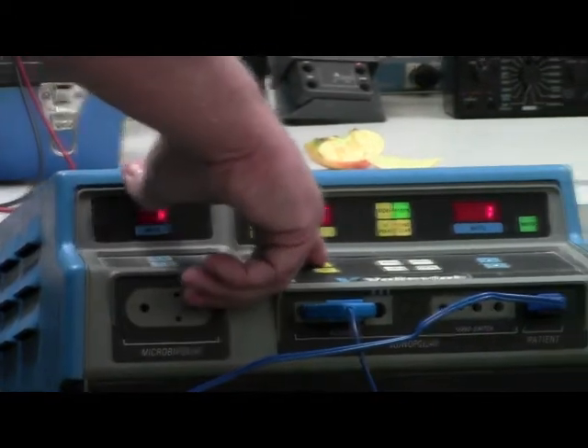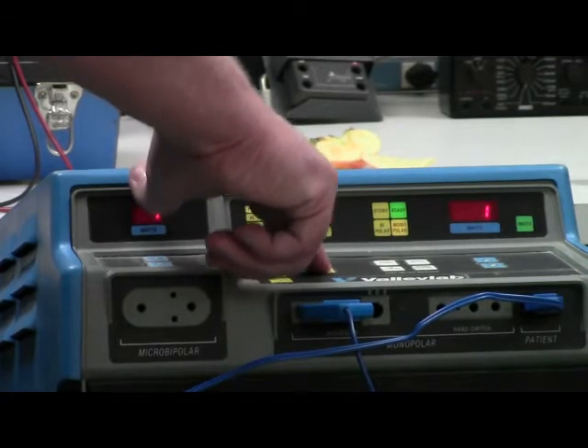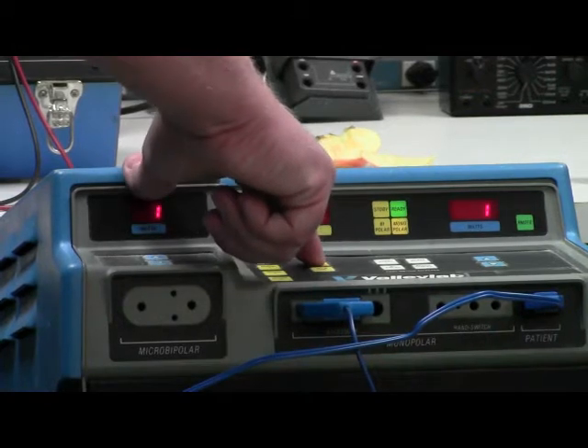Now he's going to go back to the pure cut mode and manually adjust it up or down depending on where you want to set it, eventually going up to the 300 watt maximum.